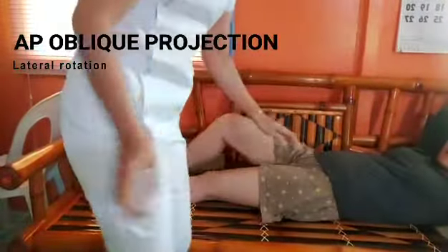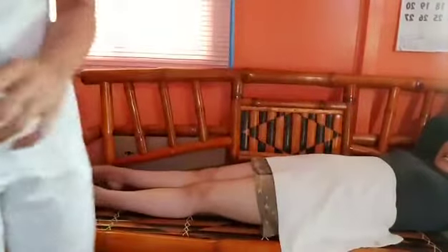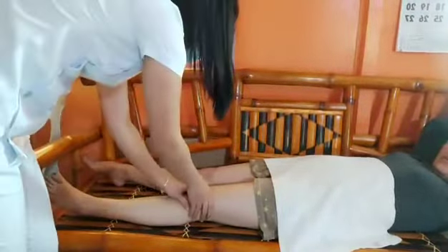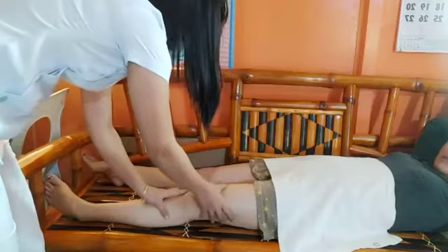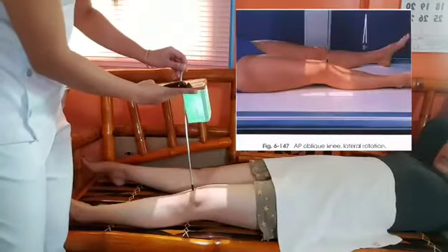Place the patient on the radiographic table in the supine position and support the ankles. Central ray directed to a point 1/2 inch inferior to the patellar apex. Variable depending on the measurement between the anterior superior iliac spine, or ASIS, and the tabletop.